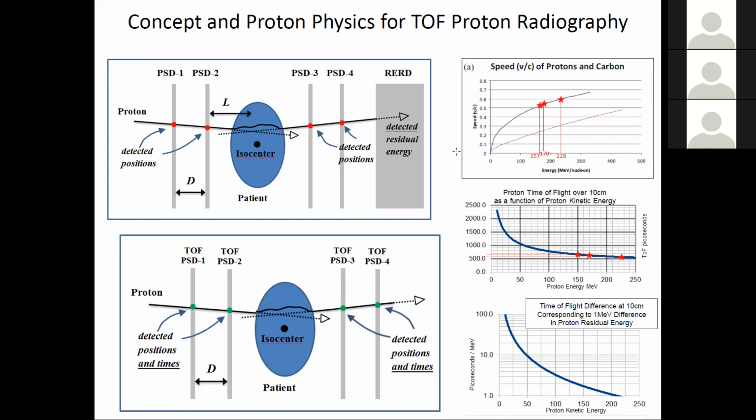The idea is that protons used in radiation therapy are subrelativistic. It means if you have a set of protons all with the same kinetic energy, they all have the same velocity. And if you happen to have sensors which are light speed sensors, and we're working on these things called large area picosecond photon detectors, used for time of flight measurements like for time of flight PET, then when you put one of those in the proton beam, you should be able to see the proton bunches.